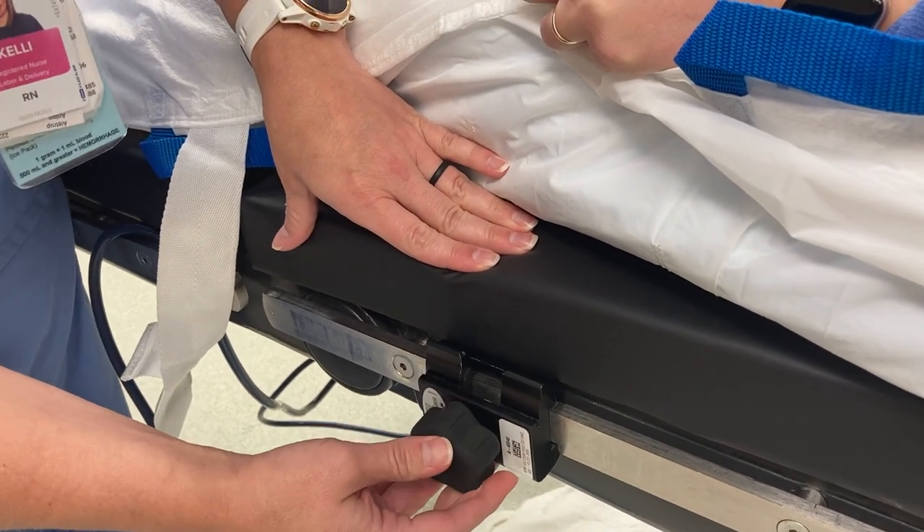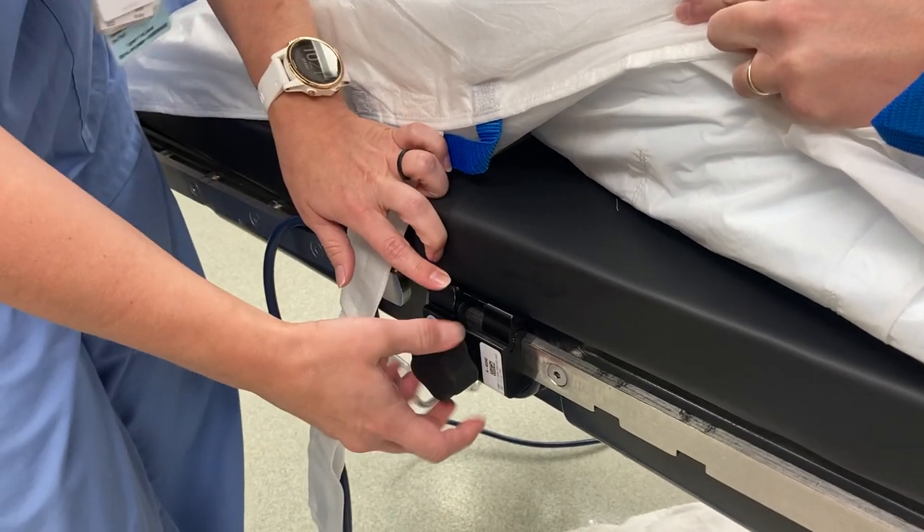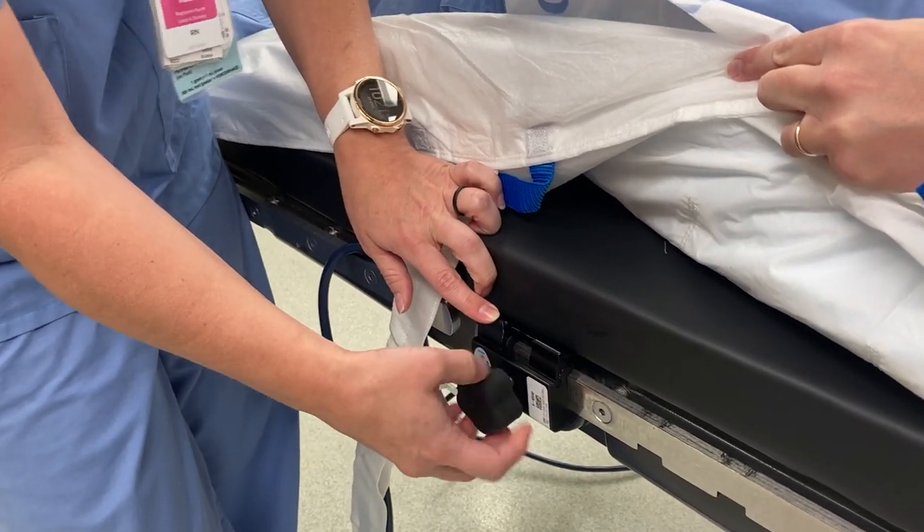We're going to attach it here and clip it in and move it forward until it hits the end. And then leave it loose. I'm loosening it up because it was tight.